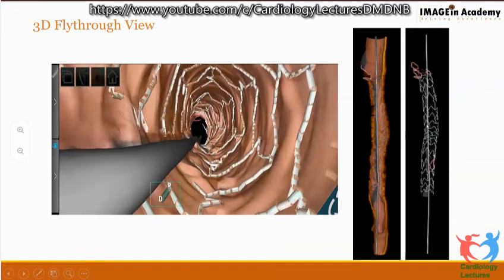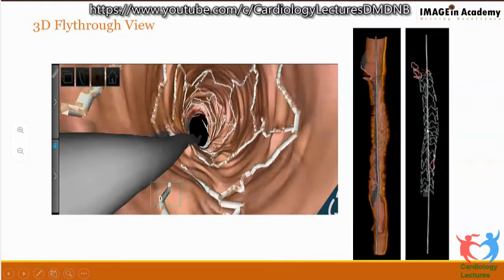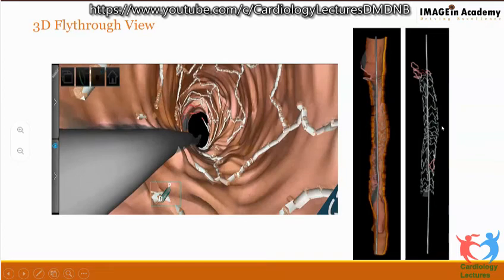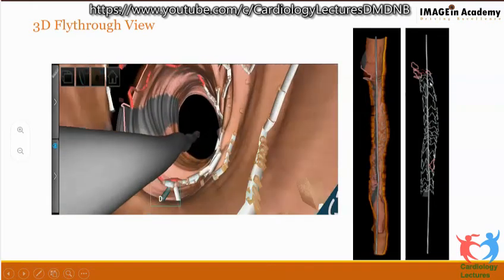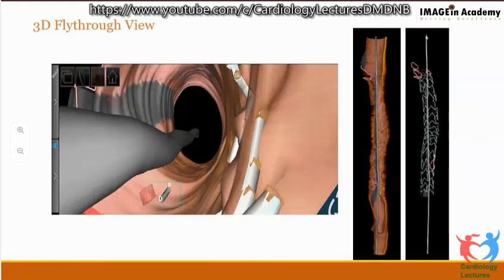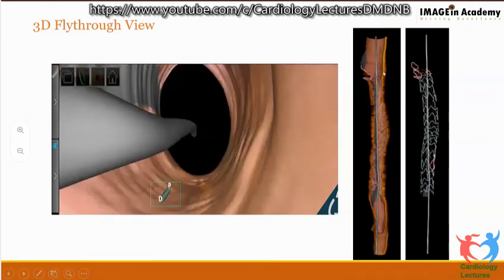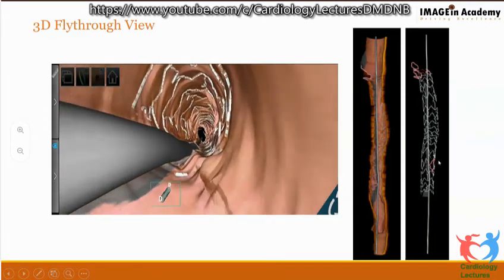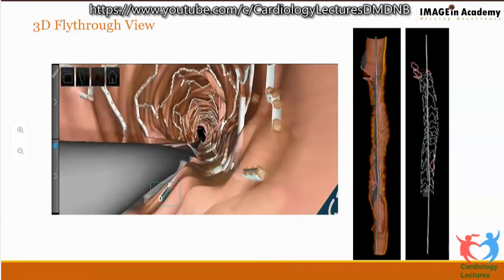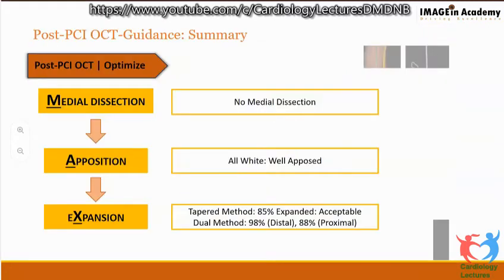Now, I'm very fond of the rendered stent view. These are the rendered stent views. Again, from the 3D bifurcation mode and the 3D navigation, you will get the stent struts only. You can remove the guide wire. Here the guide wire has not been removed. The vessel wall is also there, but all the side branches will have a pink marking, and when you rotate these images, you'll see whether there are struts across these branches or not.